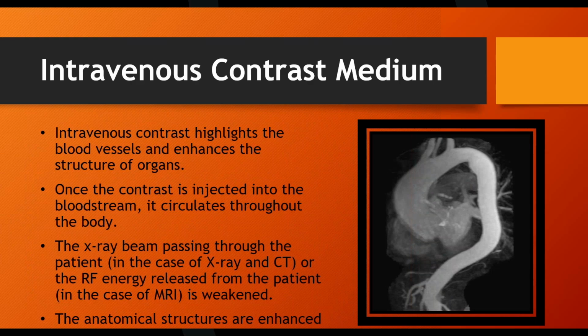There's timing. There has to be coordinated timing between the imaging system and the contrast injector. The beam passing through the patient in the case of X-ray and CT, or the energy released from the patient in the case of MR, is weakened by the anatomical structure and shows up as lighter areas on the image.